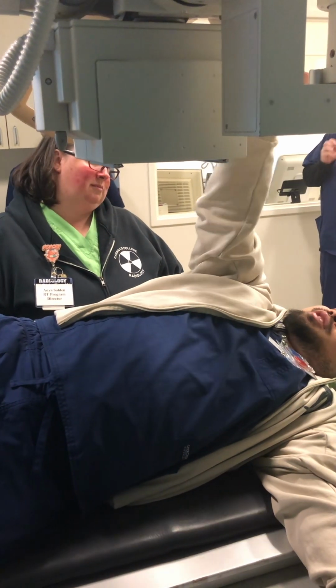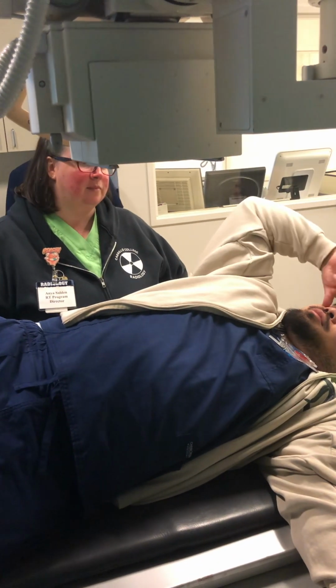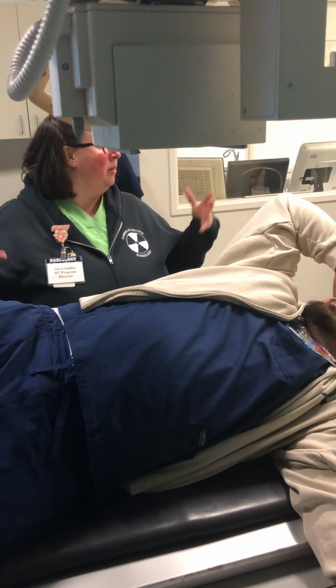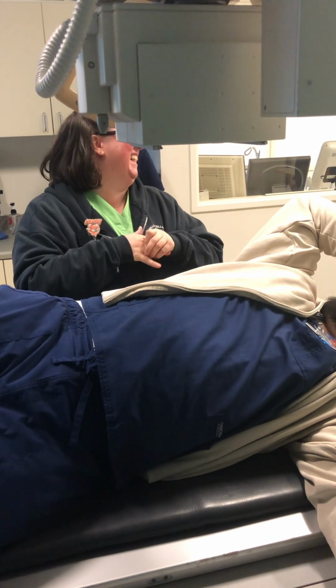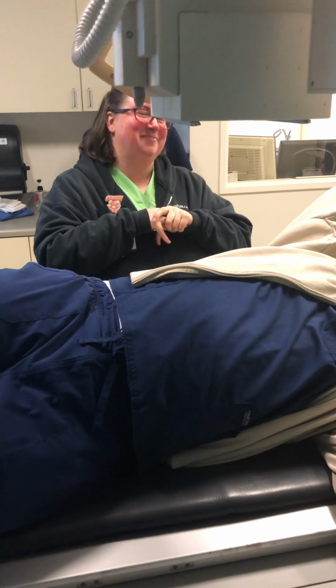You're not moving this at all, just the patient? Yeah, because it's already lined up with my bucket. Why would I want to move that? Because if I move one, I have to move the other one. It was really hard to get down. Like, now it feels normal, but yeah.